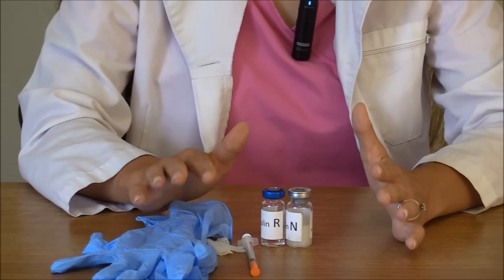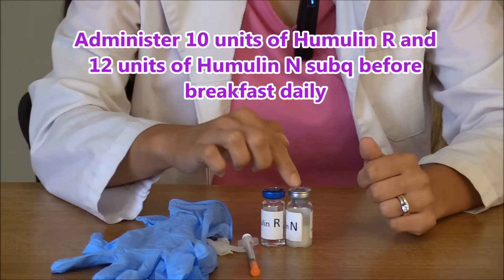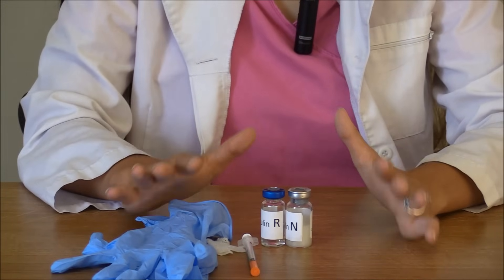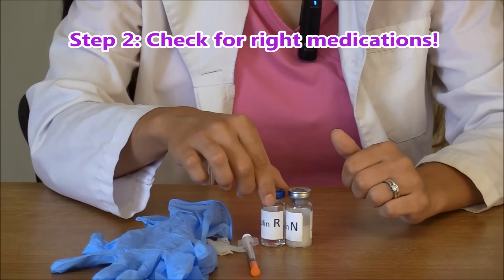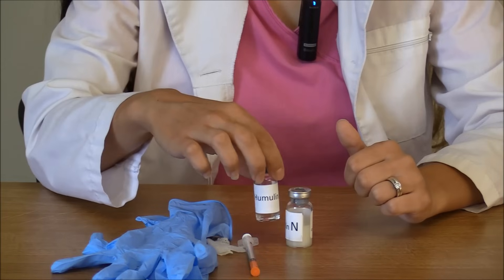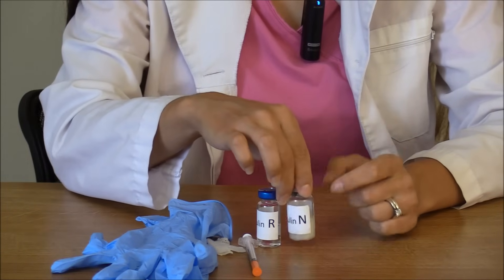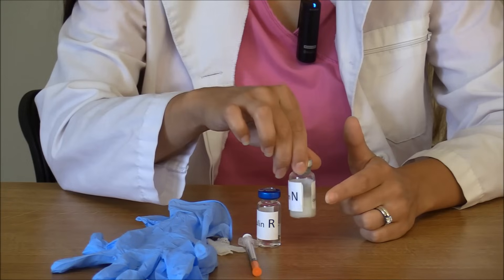Our doctor's order says administer 10 units of humulin R and 12 units of humulin N subcutaneously before breakfast daily. After you confirm that, you want to make sure you have the right medications. So you're going to take your vial and read what's on it. Here we have humulin R — you can tell because it's a clear solution — and then we have humulin N, which you can tell because it is cloudy.